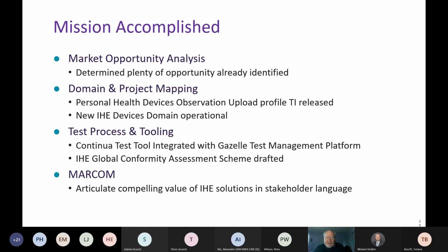So in a sense, an IHE profile is a kind of standard, but it's a meta standard. It's assembling several standards and providing a test environment and a number of things to make the interoperability actually much more operational.